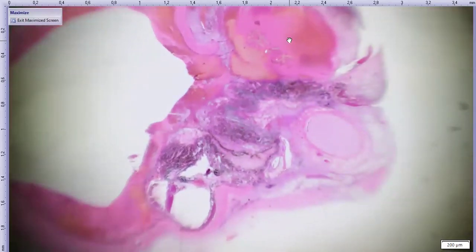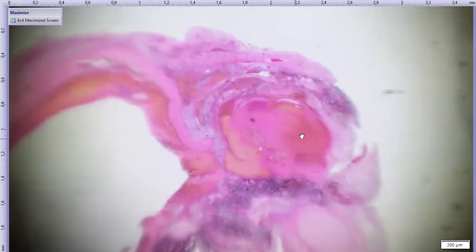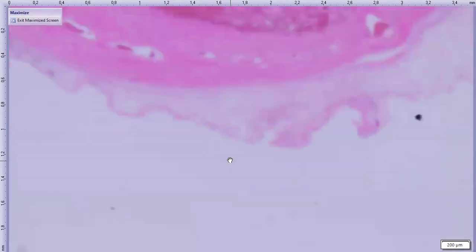And then as we move back, here's the optic nerve. So we get it sort of in a tangential cross section here. Here's one end of that sclera, and the other one is right here. This brown stuff here is uveal tissue that's prolapsing through that pretty extensive scleral defect. And then over on this side, we have hemorrhage and more uveal tissue. So we have a scleral defect with extrusion of the uvea. Never good. Yeah, never good. That's pretty consistent with pretty severe crushing trauma that causes posterior scleral rupture and then extrusion of intraocular contents.